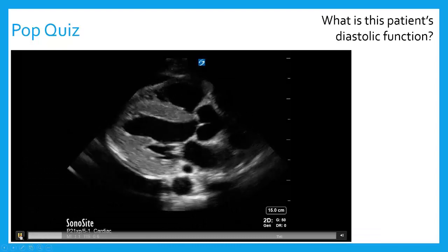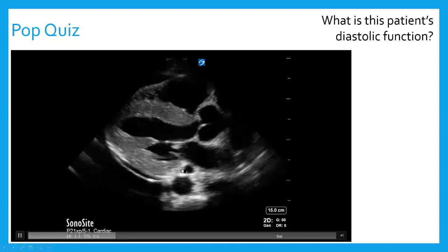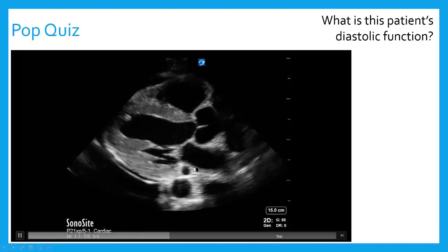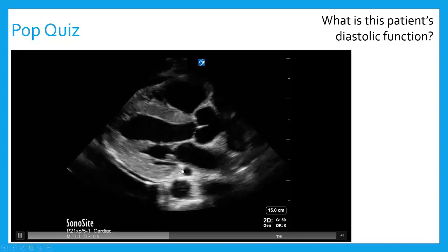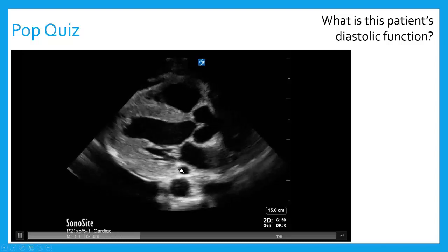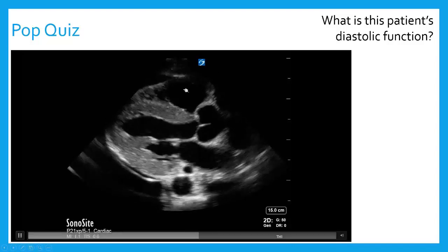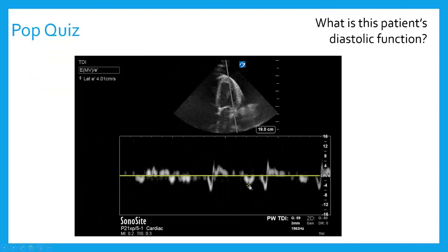How about eyeballing diastolic dysfunction without measuring mitral inflow velocities? If I look at my lateral wall where I would put my pulse wave Doppler sample box on the parasternal long axis — is there much movement there right by the coronary sinus? No, there's not. If I measured this with tissue Doppler, I would see the E-prime velocity is quite low. I can actually train my eye to see almost no movement back and forth in this myocardium. Diastolic dysfunction here is very bad. This is the same patient — probably has amyloidosis, really thick LV, really bad diastolic function, pericardial effusion, marked fluid overload, big RV, huge coronary sinus, left pleural effusion. Serious, serious diastolic dysfunction. And indeed the lateral E-prime was 4 at best.